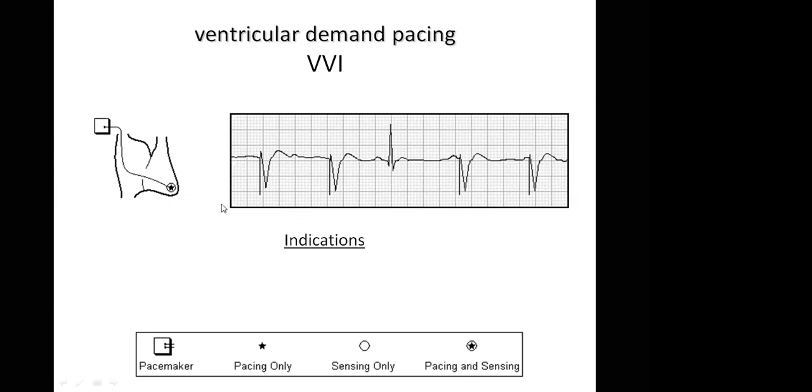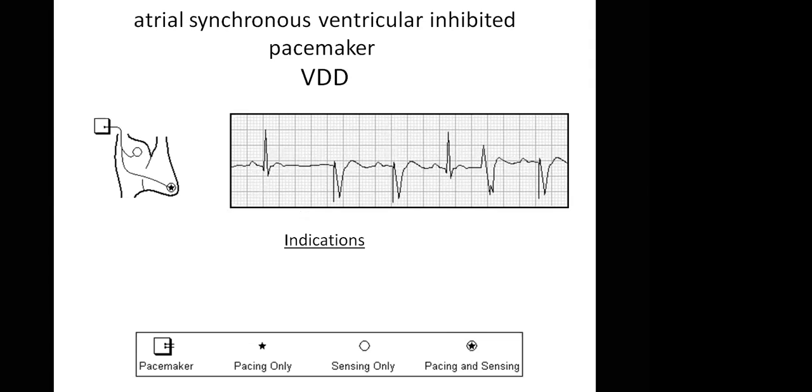Yeah. Okay. So I want to answer the broad questions. So Chief, in this case now, that other one he showed us, that's the one that has an electrode that senses both the atrium and the ventricle. Yeah, so you can see the difference now. I've brought it up. Can you see? Thank you for that question. Yes. But I wanted to explain that one fully to ensure that people get it before I bring up this one. So you can see this now.